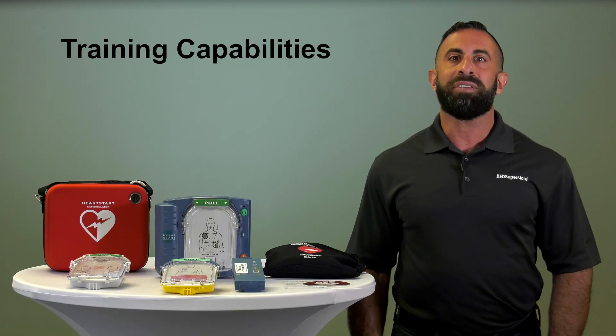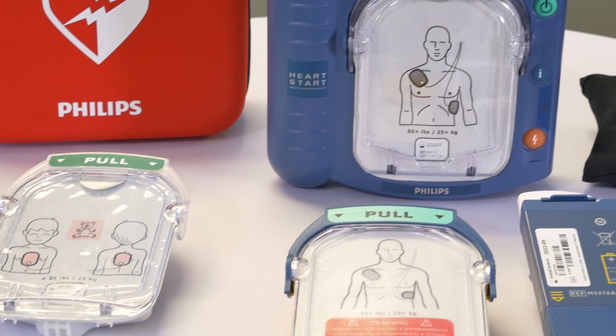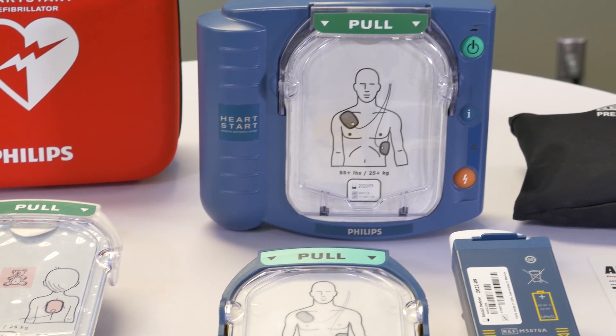To help with training, the Onsite can convert into a non-shocking training unit by replacing the electrode cartridge with an adult or pediatric training cartridge.